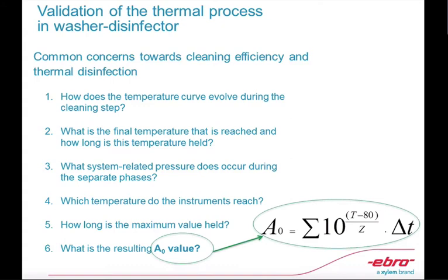There's only Ebro where I've seen a logger with a good connector for hoses, and this makes the measurements for pressure very accurate. Fourth, which temperature do the instruments reach? And fifth, how long is the maximum value held?